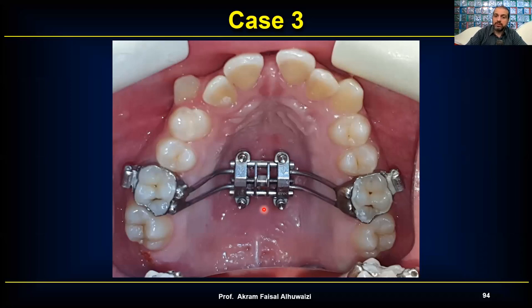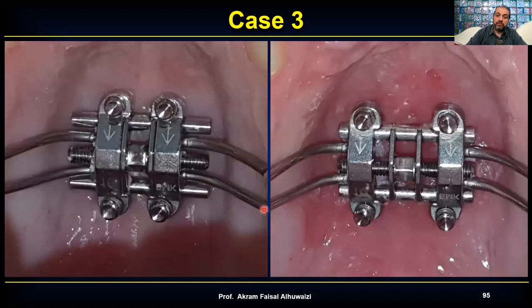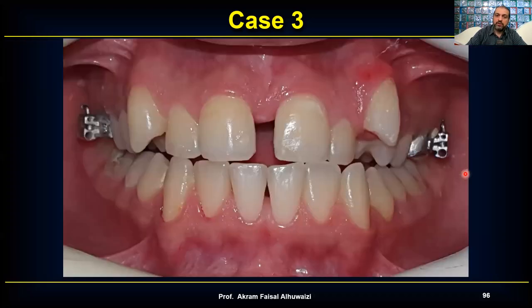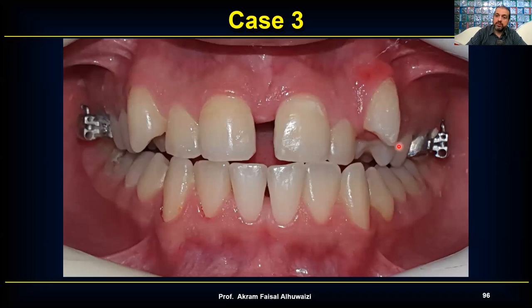Before and after: about 4 mm total opening, or 2 mm each side. I generally expand slightly more than needed to counteract relapse — if molars have been tipped buccally they'll relapse lingually, so I over-expand a little, then remove the screw and allow it to partially relapse back.